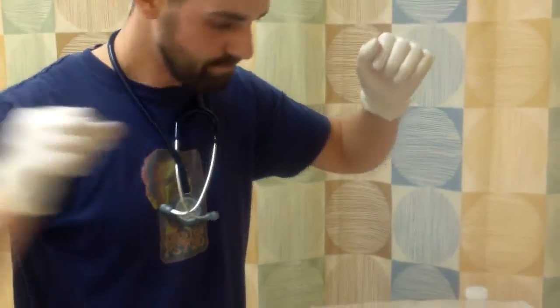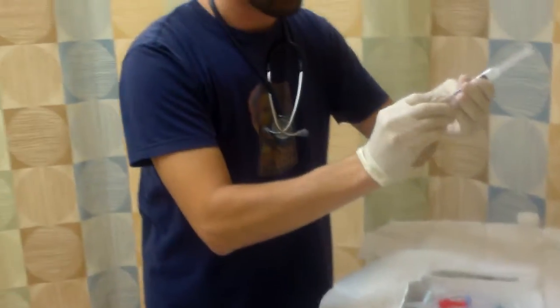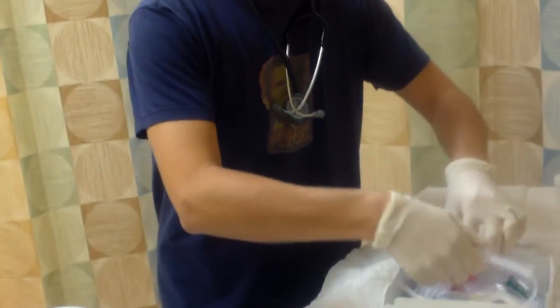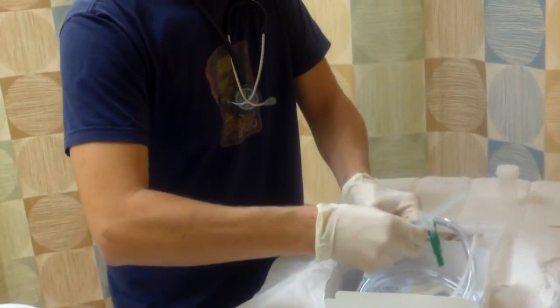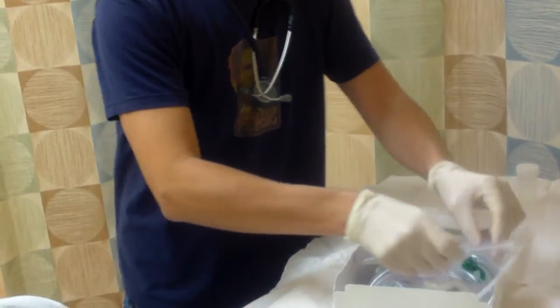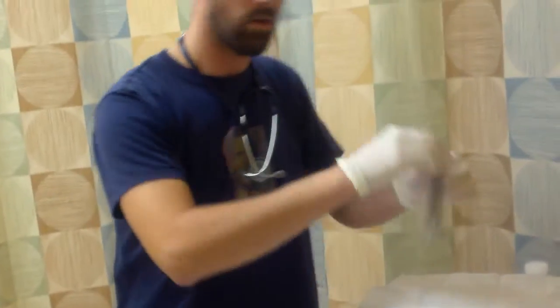It's going to be dropped right there. Alright, next thing I'm going to do is dig around here. I'm going to take off my cap. This is my water. And I'm going to insert it into my port for the balloon, for the Foley balloon. Let's stick that in there. Okay, that's good. And then I'm going to open up my iodine.